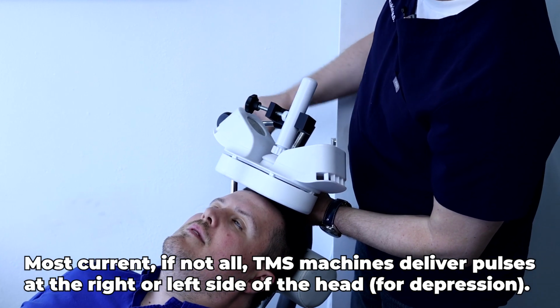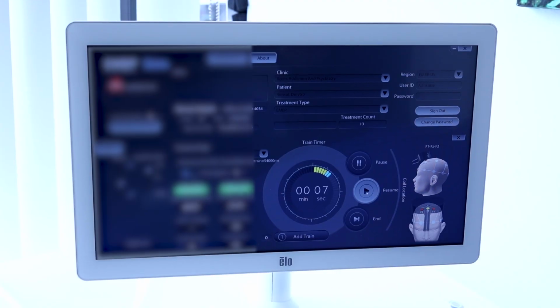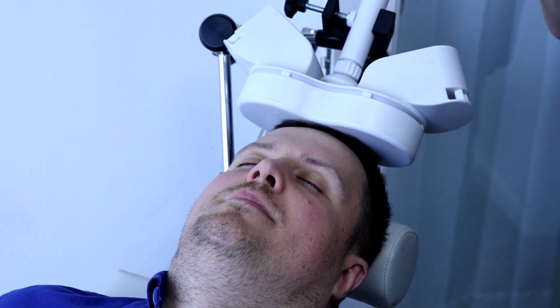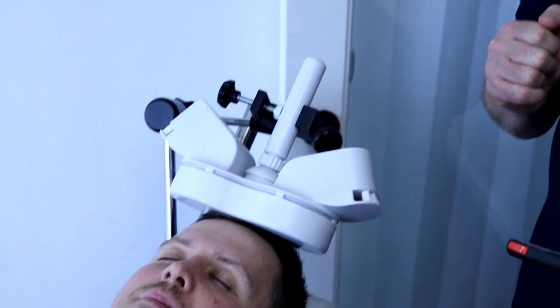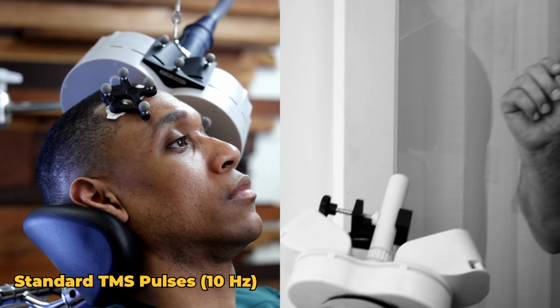Over the frontal lobes, in the middle of the frontal lobes. So this is a different protocol. Listen to the sound of the discharge. Listen to the sound, Dr. Hughes, because this is going to be very different from your regular TMS. Listen to the sound. It's not regular. I hear it. It is not regular. It's irregular. This is the difference. It is irregular because your brain does not fire at 10 hertz.